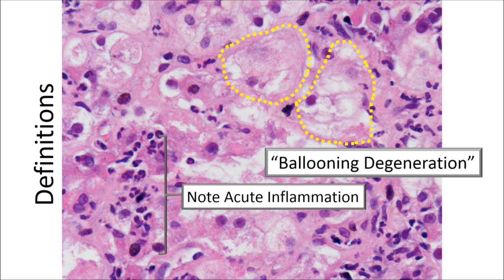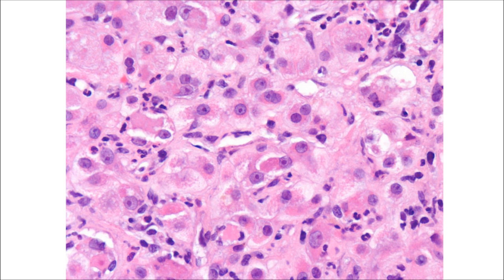What it turns out is that these neutrophils are being attracted to the following. Here is another place within this liver biopsy of our patient. There is evidence of, again, ballooning degeneration. But in addition, the arrow shows you here what is called a Mallory body or Mallory-Denk body. The name is based upon two individuals. But mechanistically, what this represents is a condensation of intermediate filaments, and more specifically, a ubiquitination of intermediate filaments and their subsequent condensation that leads to the accumulation and gives this Mallory body. So Mallory body represents a problem in the cytoskeleton of the hepatocyte, and it may be a result of a more proximal steatohepatitic pattern of injury.